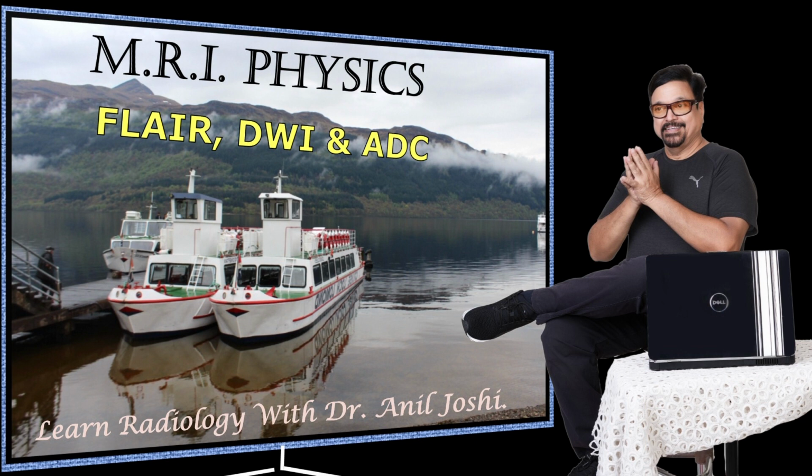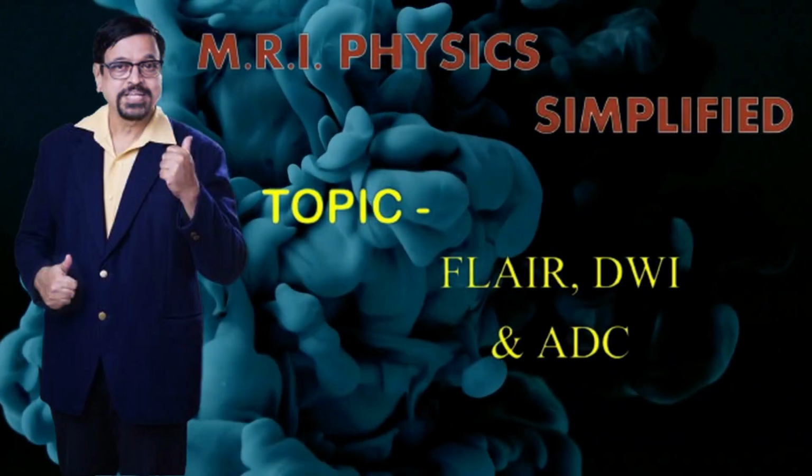Today's topic is based on MRI physics. MRI has got different sequences. Today's topic is based on the FLAIR, DWI and ADC.